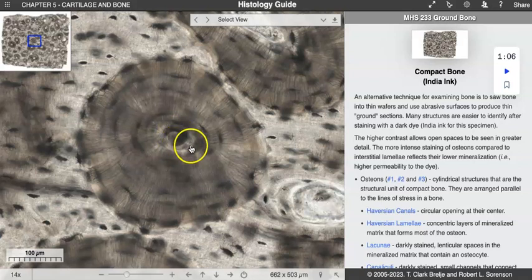All right. Each one of these tree rings of this bony matrix is going to be referred to as lamellae. And you can think of it almost like laminate flooring, like you have layers and layers of this bony material. And it is laid down when it is formed. It lays down in one tree ring after another after another.